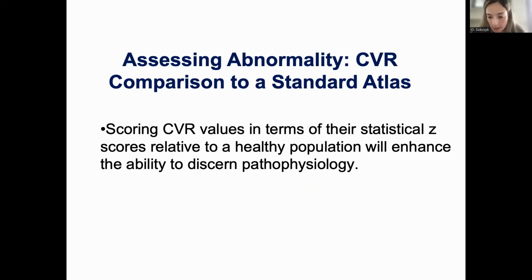Understanding the choice of stimulus and the pathophysiology of cerebral blood flow response to CO2 can aid in the development of standardized methods of CVR for clinical utility. And that's what we've been trying to do in our lab over the years. For example, we investigated development of a standardized method to aid in a quantitative interpretation of CVR maps. How can a clinician quantify abnormality?